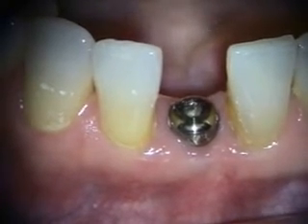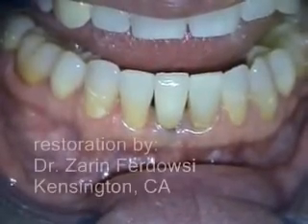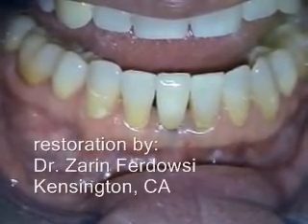So next we'll see the final tooth — the follow-up of the implant in the number 25 site. We'll take a look at the x-ray next.